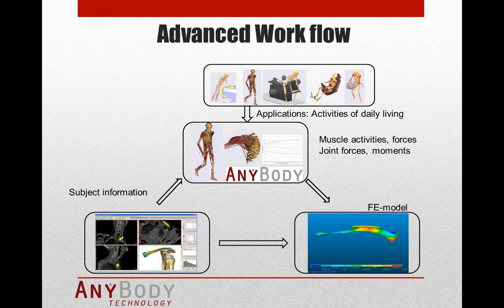You can also fully adapt this human body model. So for example, if you have subject information from MRI or from CT, from Materialise, for example, from Mimics, then you can use that information to make a subject-specific model, and then you can output everything into FE.